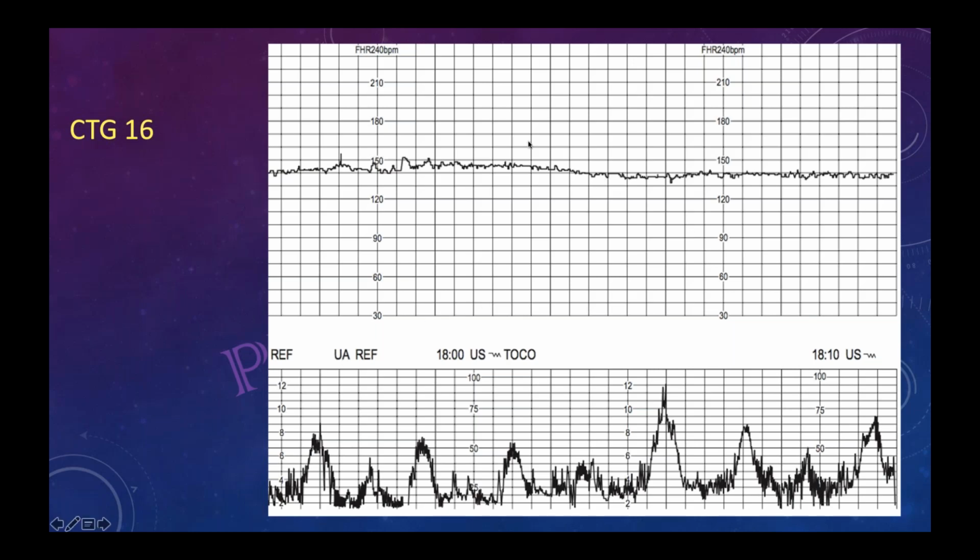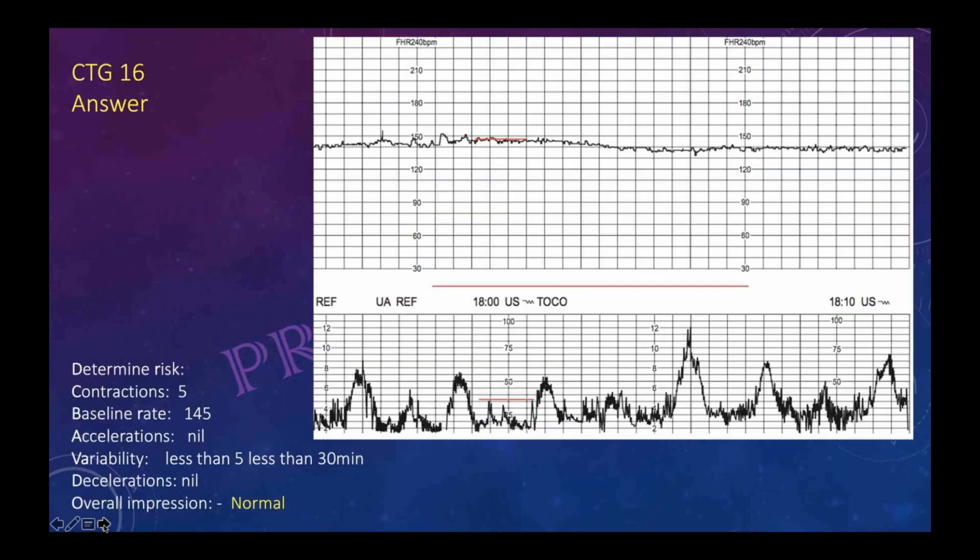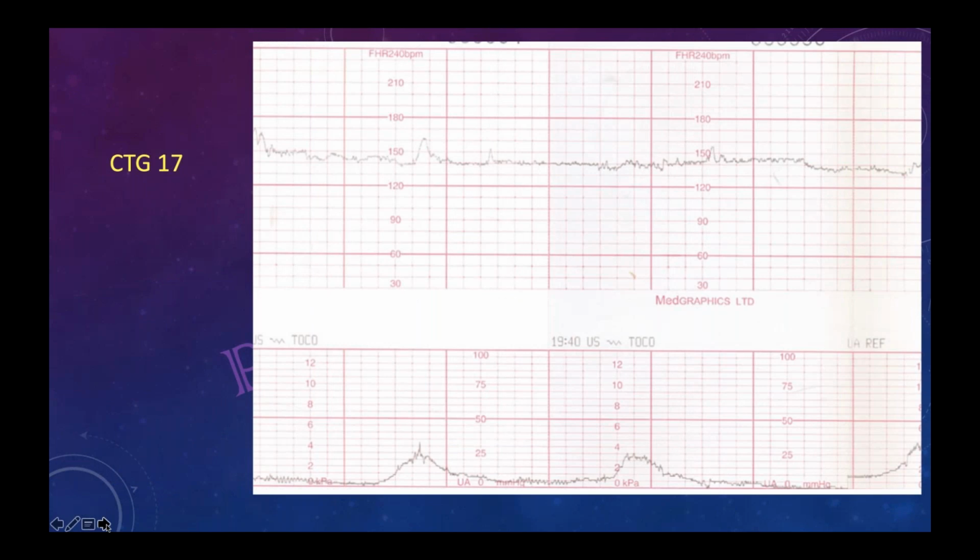Yes. So if you see it without categorization, it will appear abnormal to you. But if you put it in a feature, it becomes normal. True. Okay. Thank you very much. Who wants to do next? I'll do next, ma'am. Yes, do. Meena.